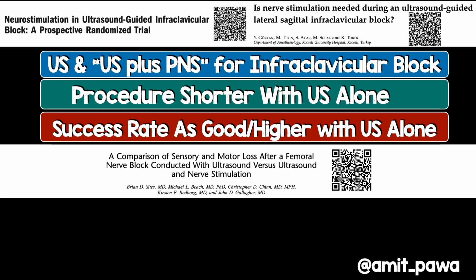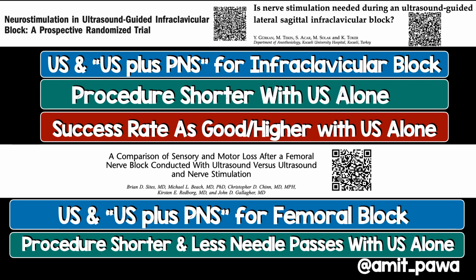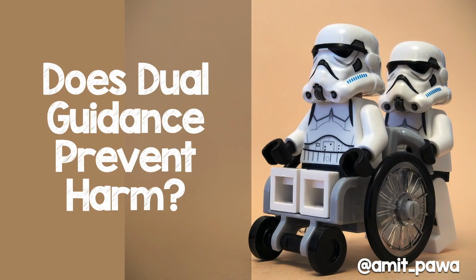This was another study now looking at femoral nerve block, and what they determined when they took ultrasound versus ultrasound plus peripheral nerve stimulation for femoral block was that actually the procedure time was much shorter and there were fewer needle passes when we used ultrasound alone. So that's not really giving me any real reason to use peripheral nerve stimulation.